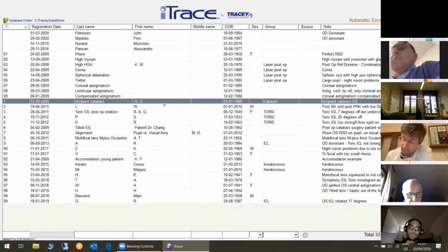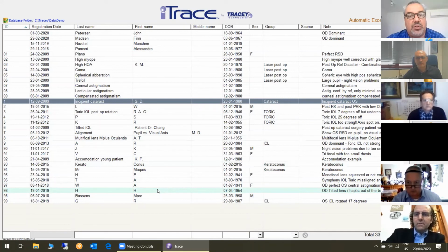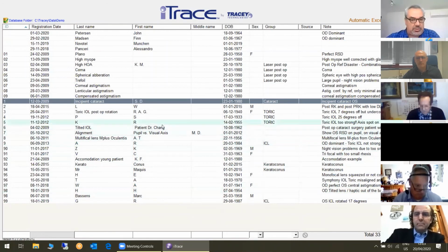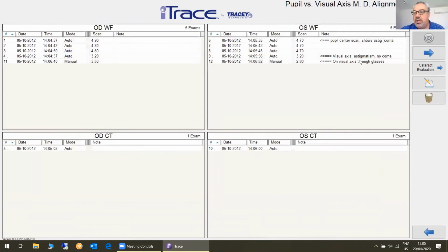Yes, I would take the largest scotopic scan size that you can do. Why not bigger? Because bigger the patient is not using. Like we have seen in the case here, where the IOLMaster and the LENSTAR and all the others gave the wrong axis because the highest point was not where the patient was using. So I would go for the largest scotopic pupil size. Now, I will try to explain with an example. Here, let's go here.